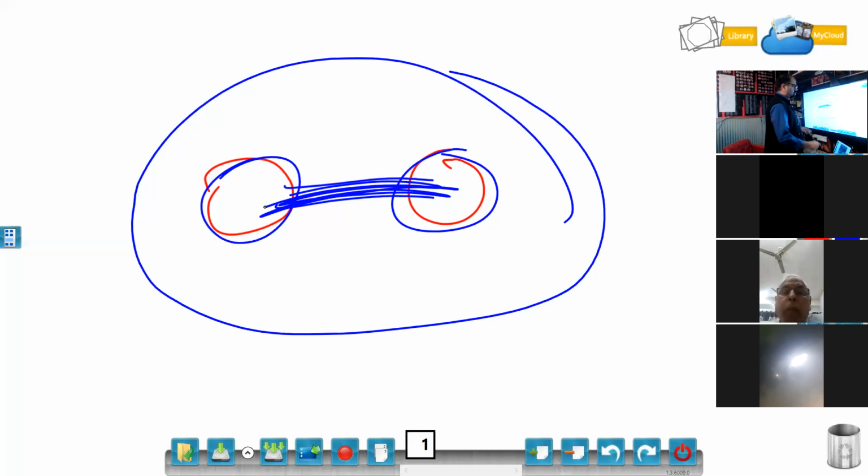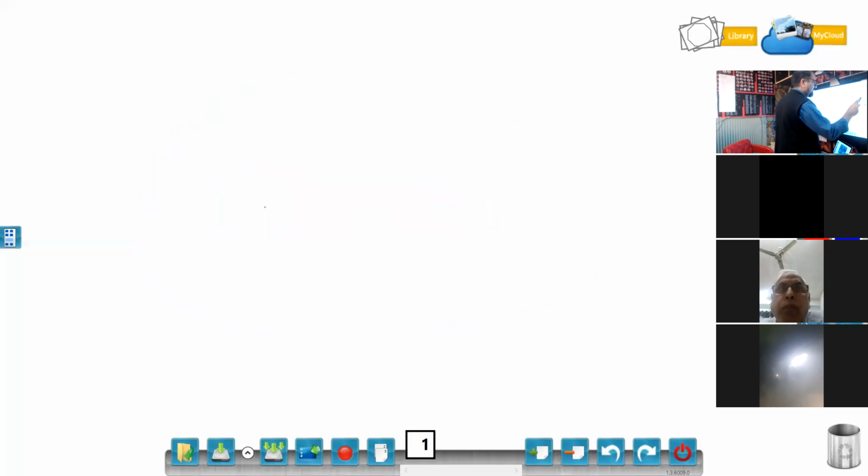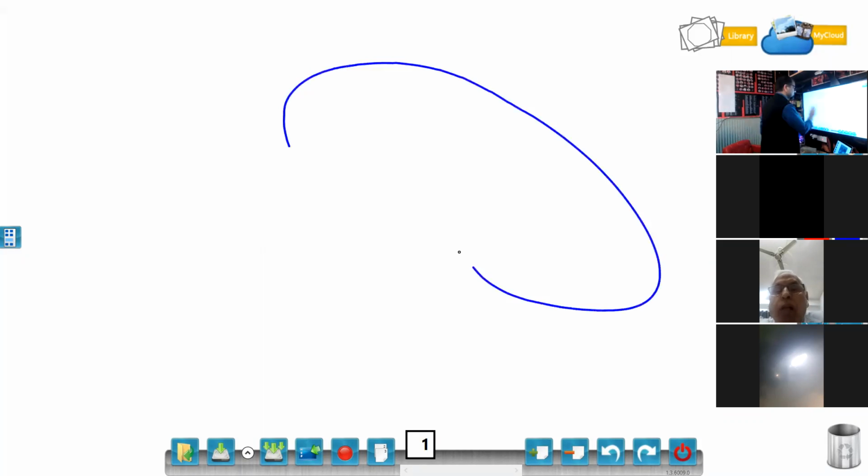Now, one more question. Not crossed renal ectopia, this is the extrarenal pelvis, which is again a normal finding. This is the kidney. This is the extrarenal pelvis.